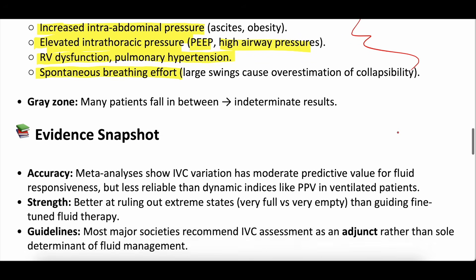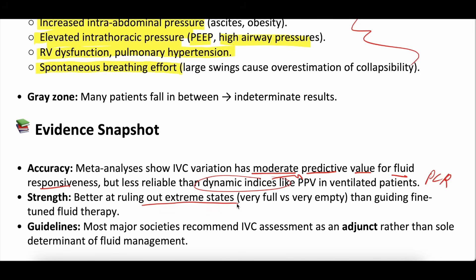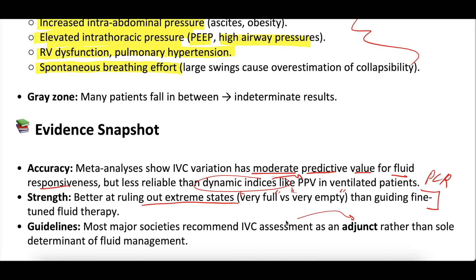Looking at the evidence: IVC variation does have moderate predictive value for fluid responsiveness, but it's still less reliable than some dynamic indices like pulse pressure variation or passive leg raise. Its strength is better at ruling out extreme states — a very full, plump and plethoric IVC, or a very empty, tiny and collapsible one — which is probably more meaningful for identifying hypovolemia or hypervolemia. Most societies say IVC assessment is reasonable as an adjunct, but don't use it as a sole determinant for whether a patient needs fluid.